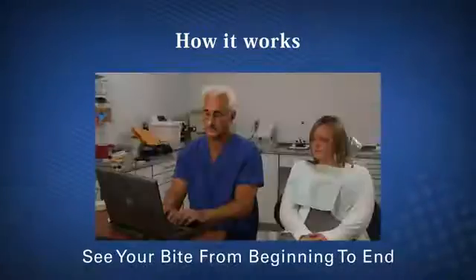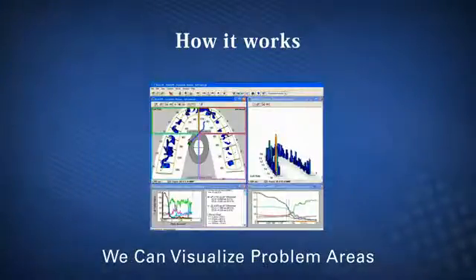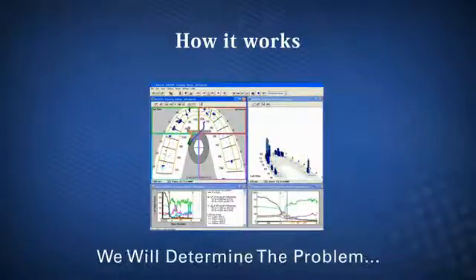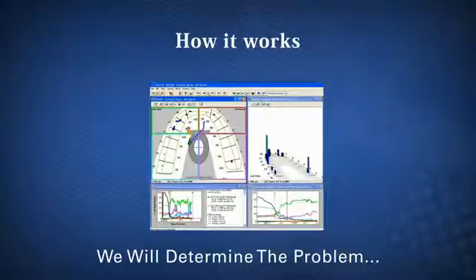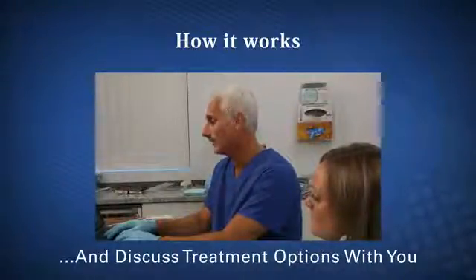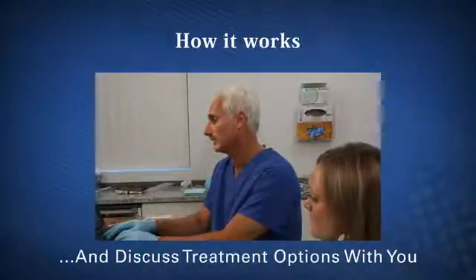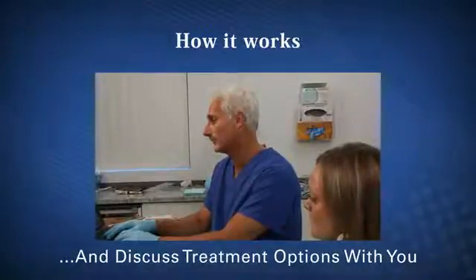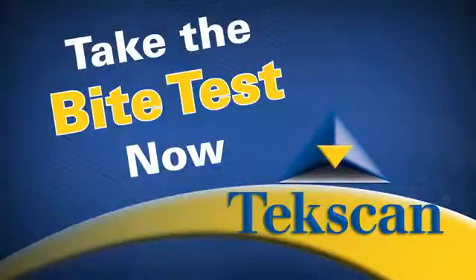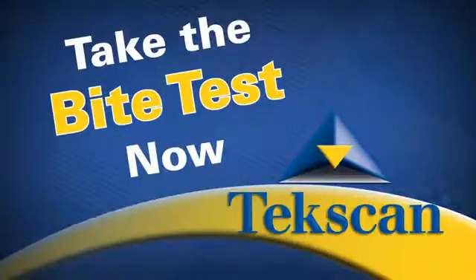We can show you your bite from beginning to end and all that is happening in between. This will allow us to immediately visualize problem areas before you leave the office today. After we diagnose the right problem, a range of treatments can be used. We will discuss the different options with you once we have identified what the problem area is. So if you think your bite might be off and you're experiencing any symptoms, ask us if a bite test is right for you. Thank you.